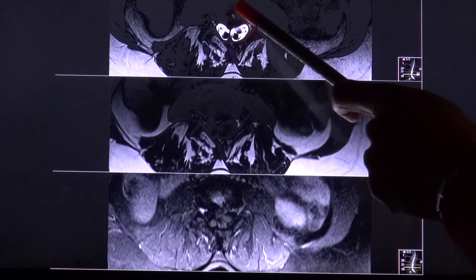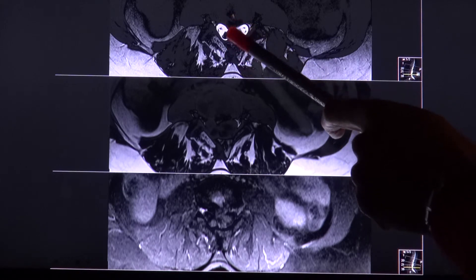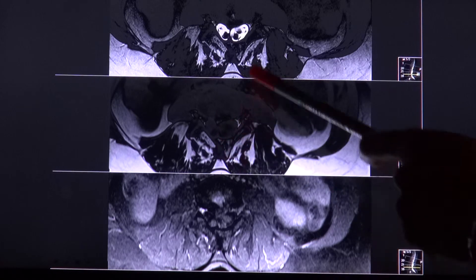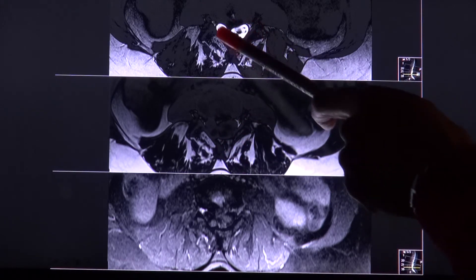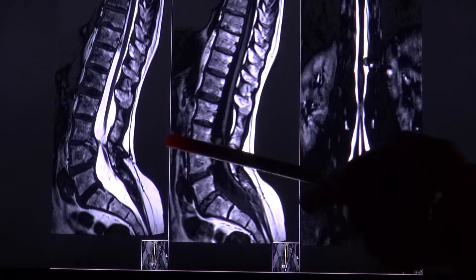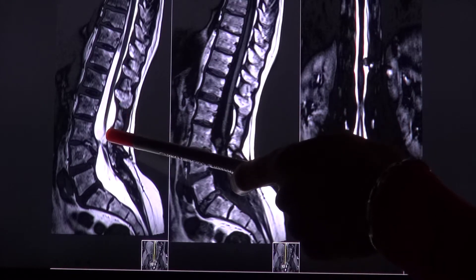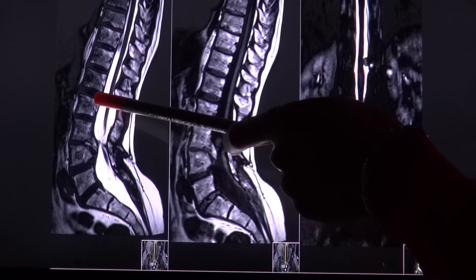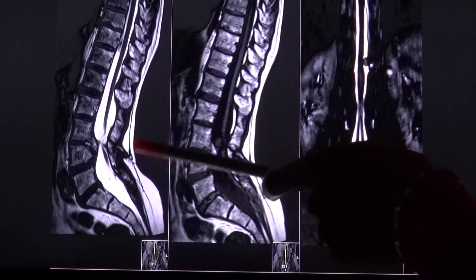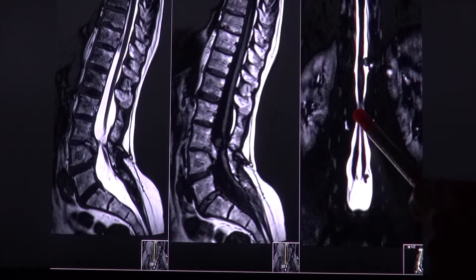Here you can also see the septum, which is fibrous in this case because it is dark on T2 and also cannot be seen on the T1 image. There is one common dural tube. On the sagittal plane you can see a conus that is below the second lumbar vertebra, so you can speak of a tethered cord in this case. And here again on the coronal view you see the split hemichords.